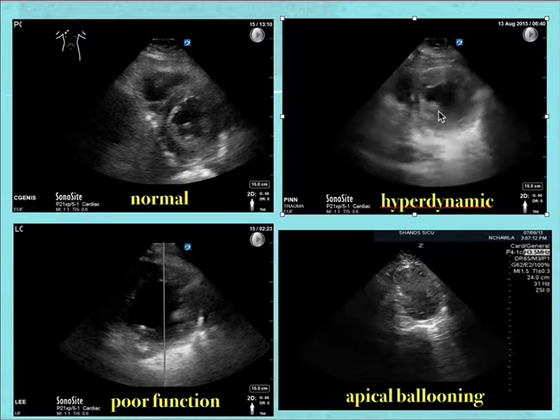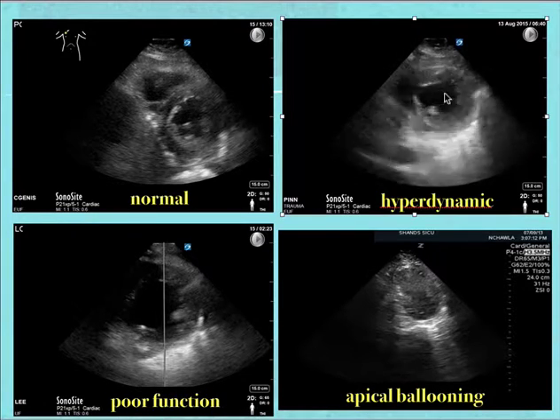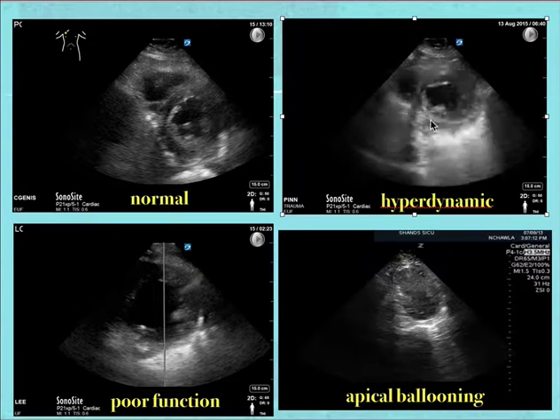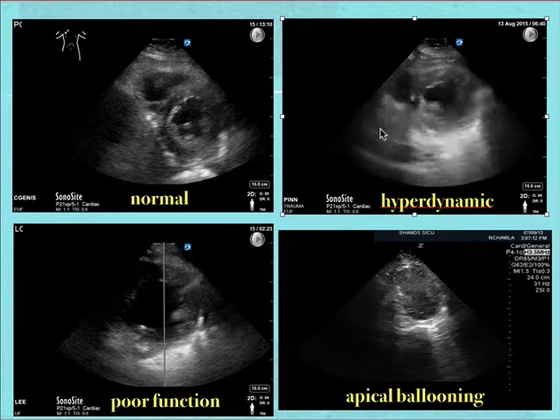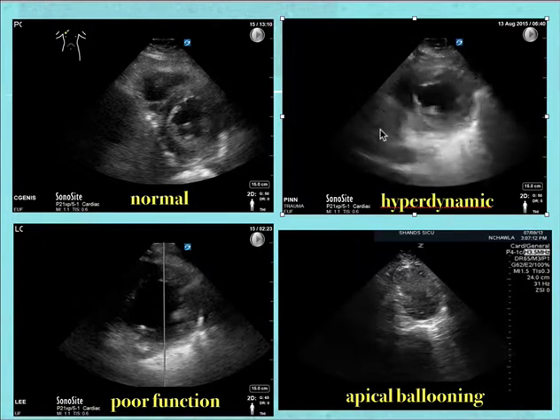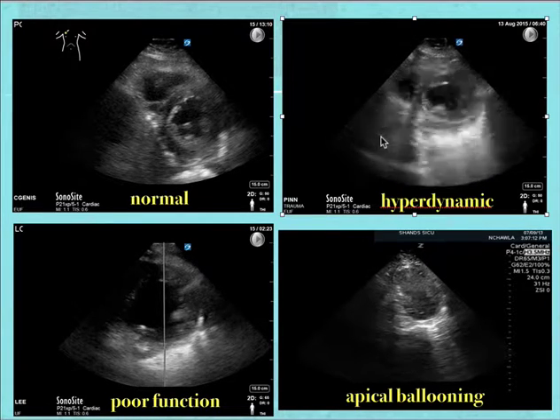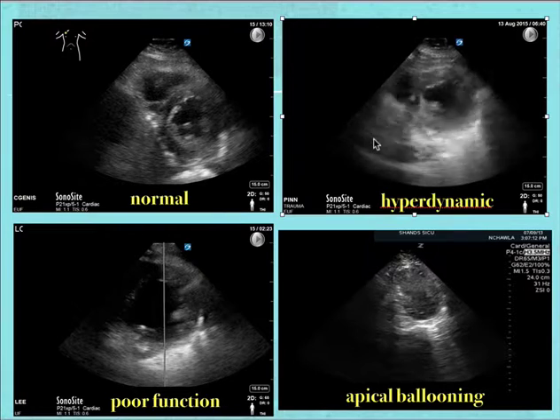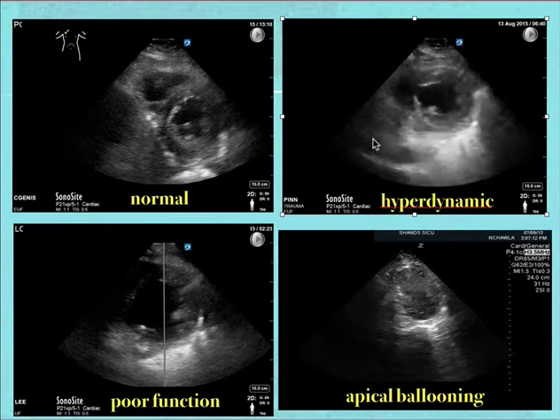In this picture, we're confirmed at the papillary muscle level and can see the whole LV is almost obliterating. If you have the correct scenario — trauma or sepsis — and you see this along with A-lines throughout the lung field, that indicates the patient may require more fluids.